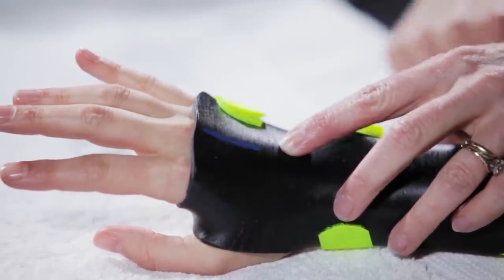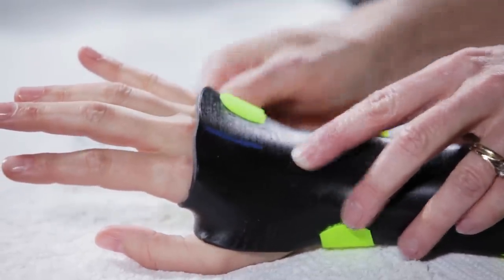Mark the orthosis for correct placement of the adjuster. Remove the orthosis from the patient.